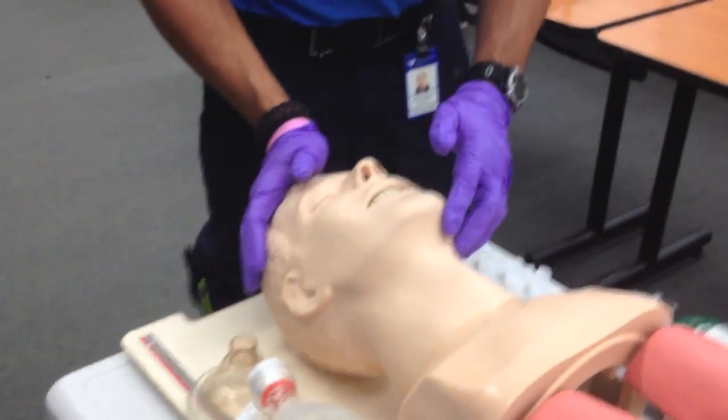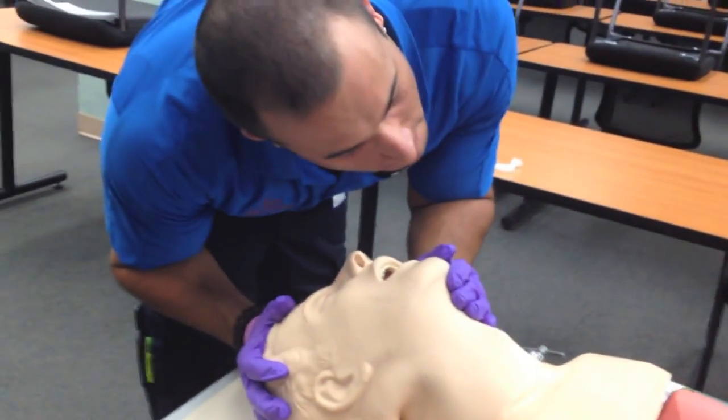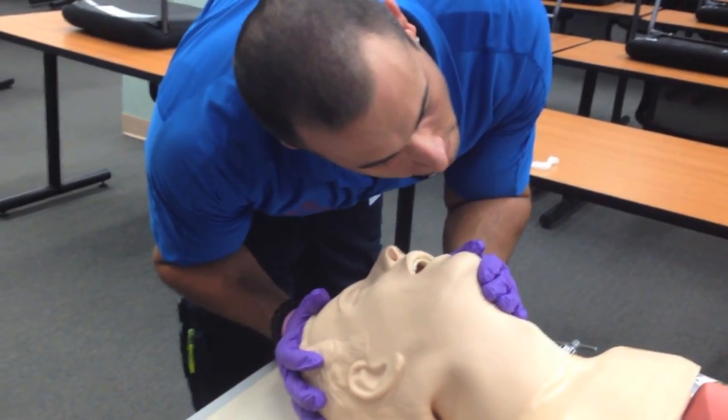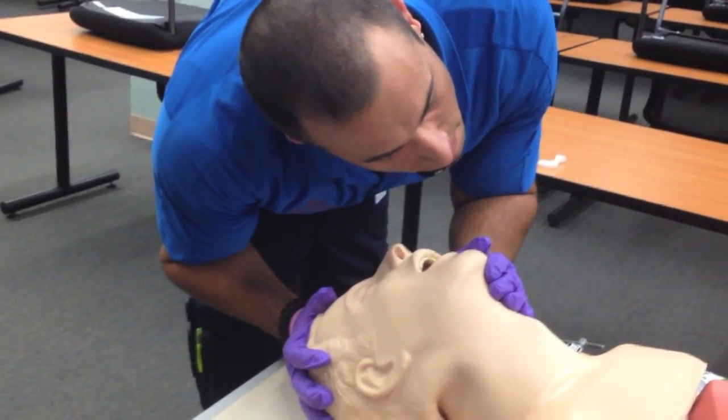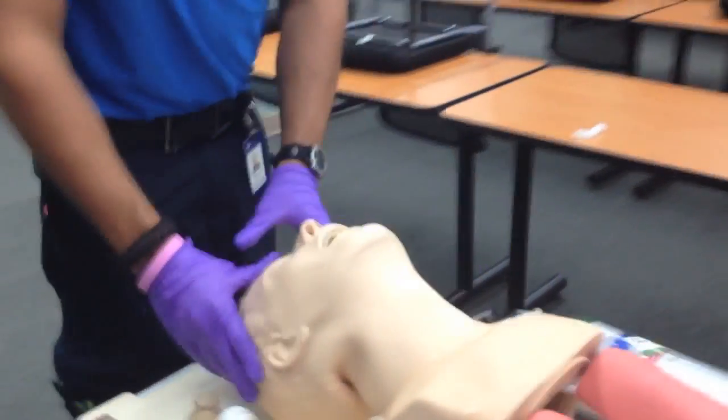The patient is unresponsive. I'm going to open the airway and check for breathing for five, no longer than ten seconds. I don't feel anything — no signs of breathing. The patient is apneic. I'm going to call for ALS.